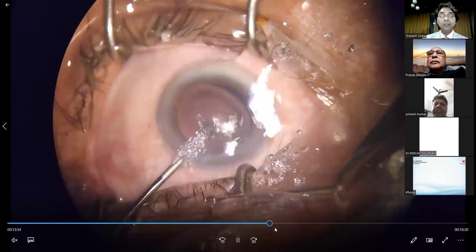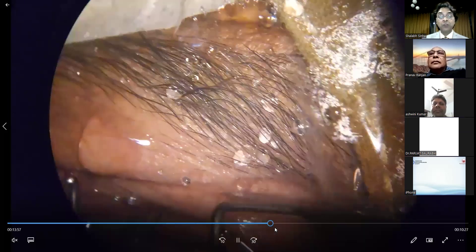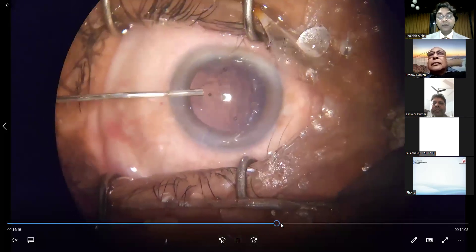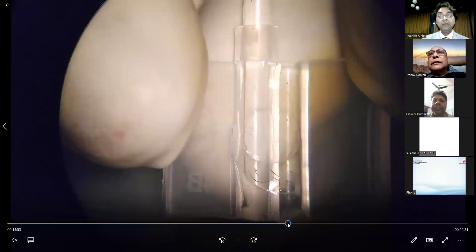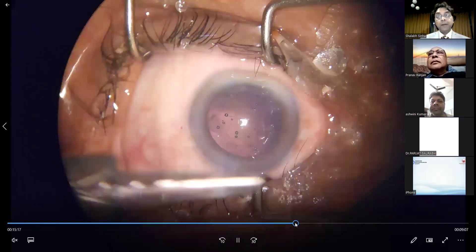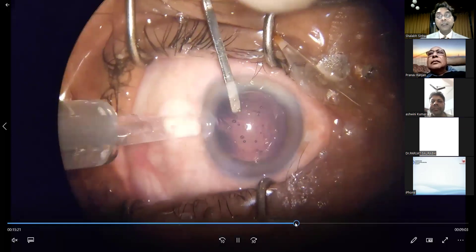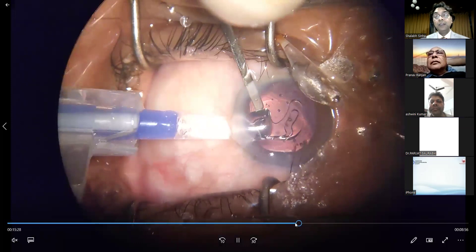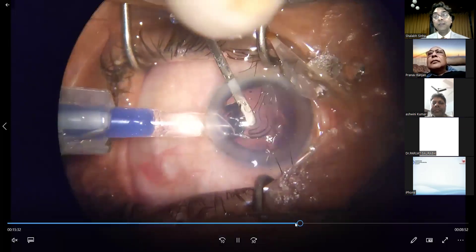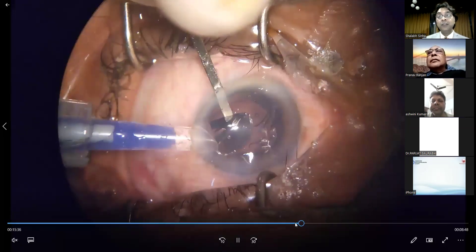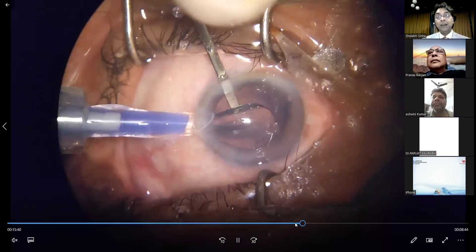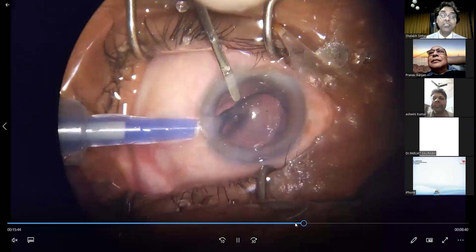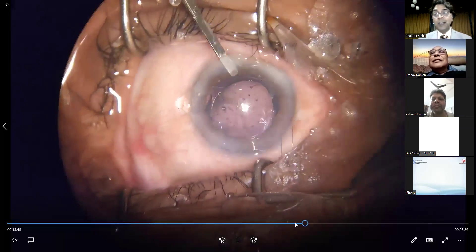Now it's a clean bag — no more vitreous in the anterior chamber, no prolapse. Viscoelastic is injected and the intraocular lens is loaded. At this point I did not have a backup three-piece lens, so the lens originally meant for the patient is loaded. A wound-assisted delivery is being done; my intention is to place the leading haptic into the sulcus, using the spatula to guide the delivery. Unfortunately, I was paying more attention to the injection part and not the leading haptic — now part of the IOL is in the vitreous.